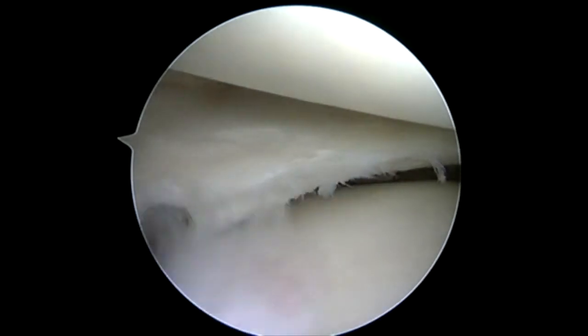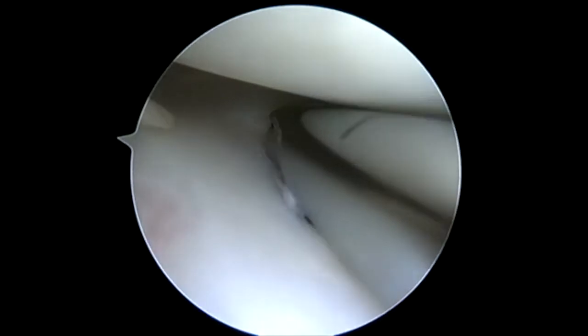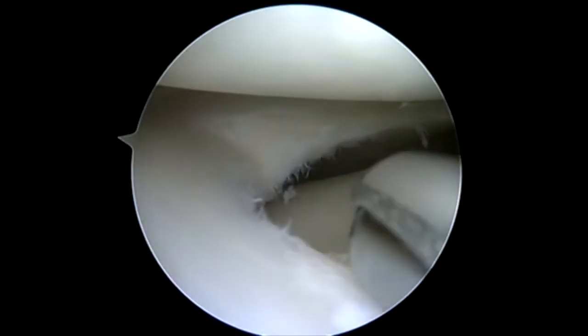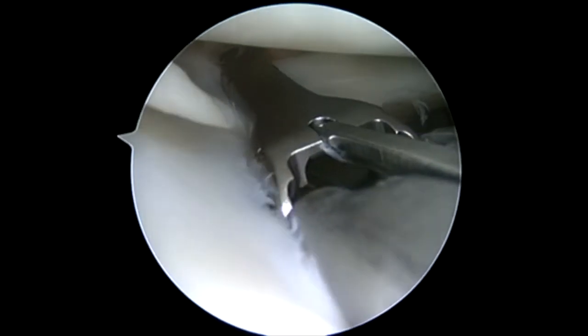You can see we're probing our split. We know that we need to repair this. If we excise this large volume of meniscus, this patient's going to be at high risk for arthritis — a very young 17-year-old male.